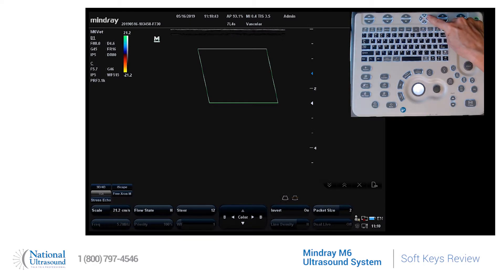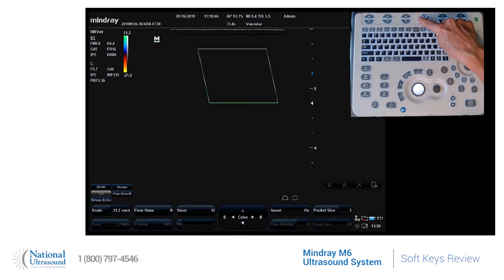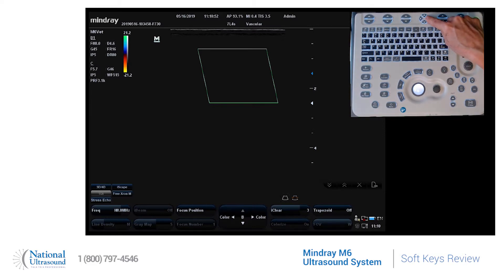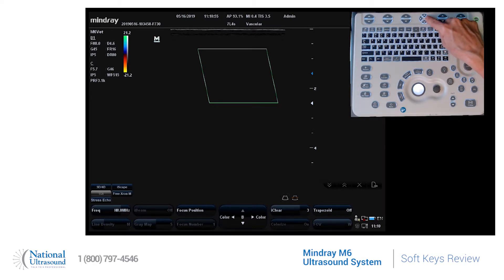On this middle button, if I press the one to the right or the left, it tells me that will take me back to B mode parameters. I'm going to press that. Now you will see that the options available on the soft keys are B mode parameters — no longer are they color.